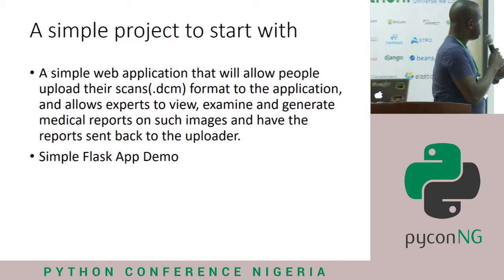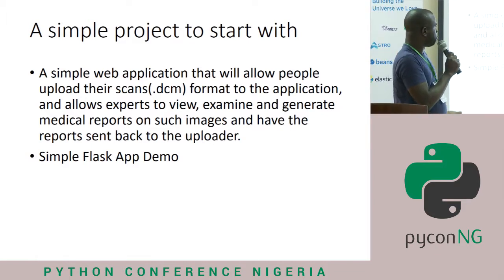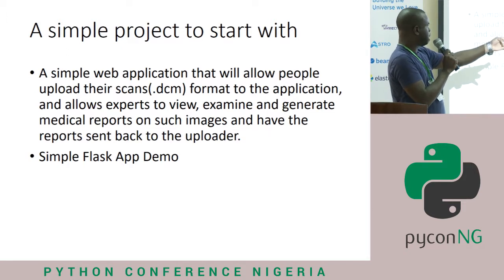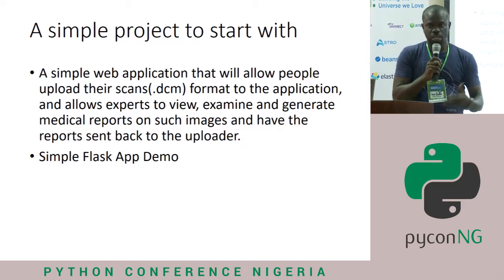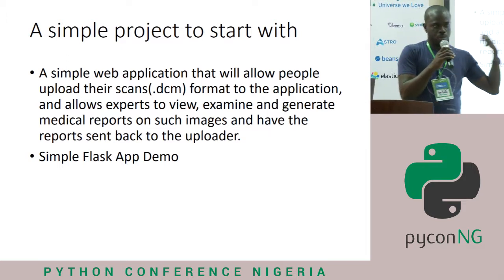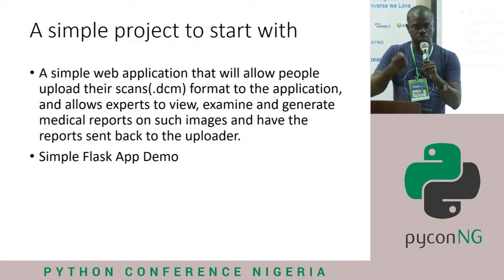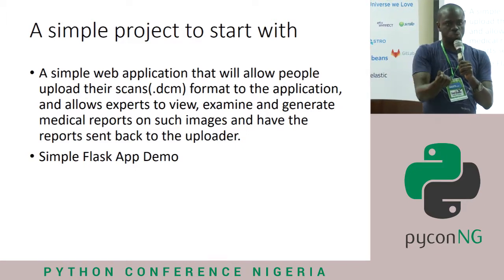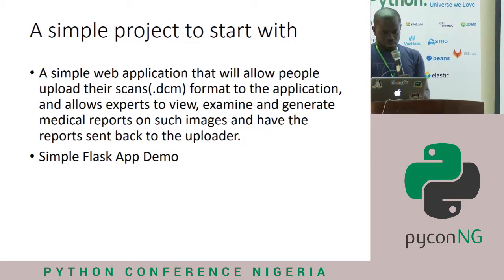This would probably be a simple project to start with: a simple web application that would allow people to upload their DCM files to the application, and allow experts to view, examine, and generate medical reports on such images, and have that report emailed back. Imagine how it would be if you could sit down at the comfort of your home, upload your image to a web application, and someone at the end views the image and sends a report back to you that makes meaning, that I can take to any other hospital and have it used. Wouldn't that be useful to people? So that is what I would show.